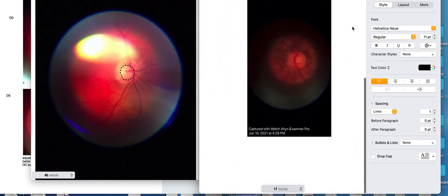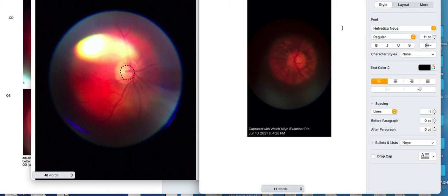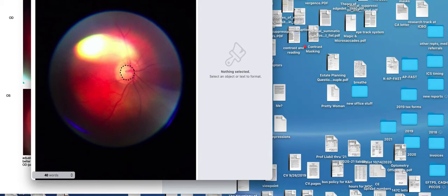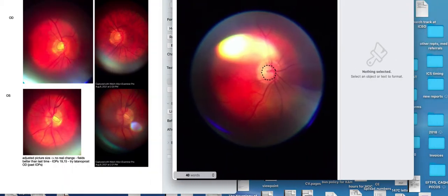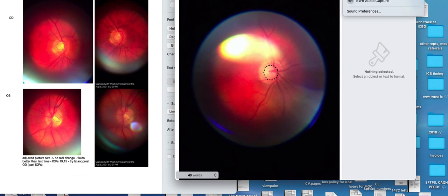Some of the things that come into play with pictures, of course, how big is the pupil, and are they squinting their eyes. We tend not to yell at people a lot. We just accept it. But we try to get the best picture that we can.